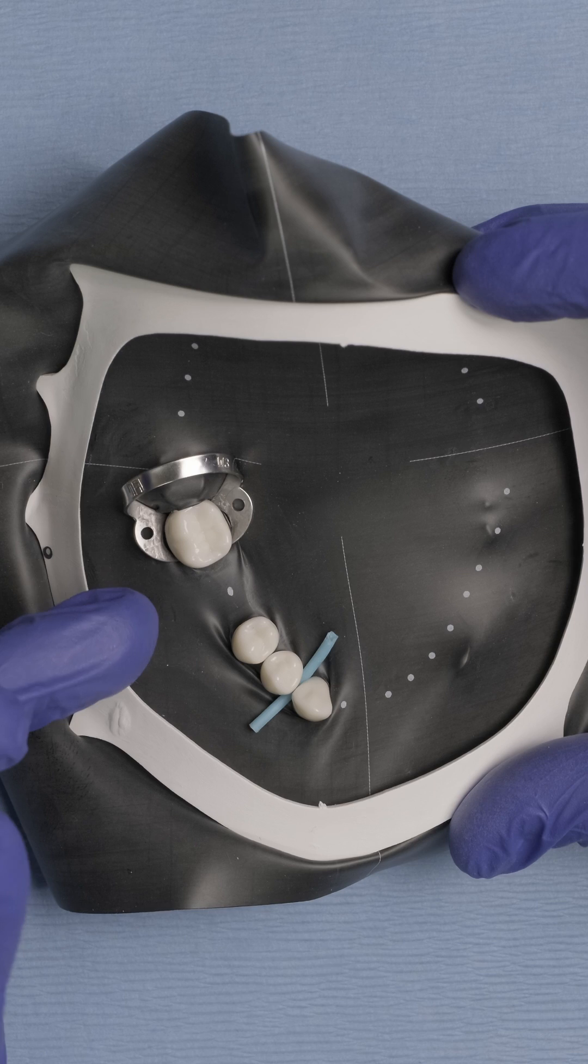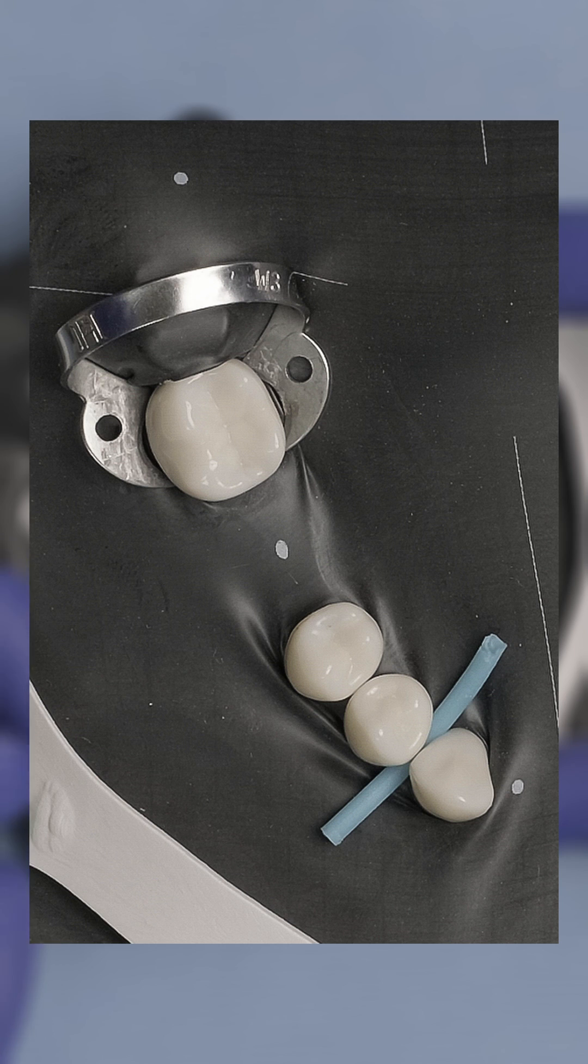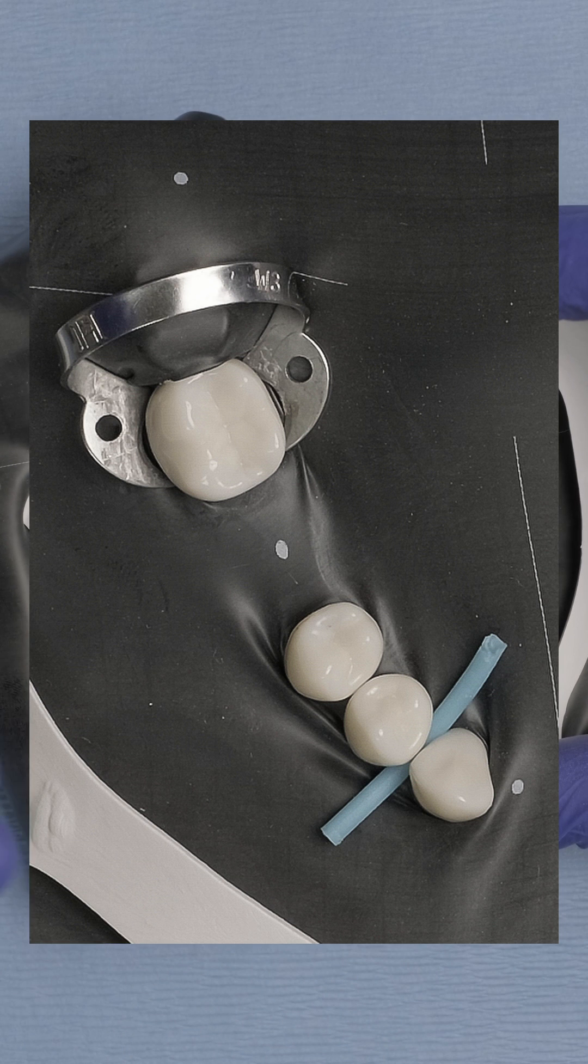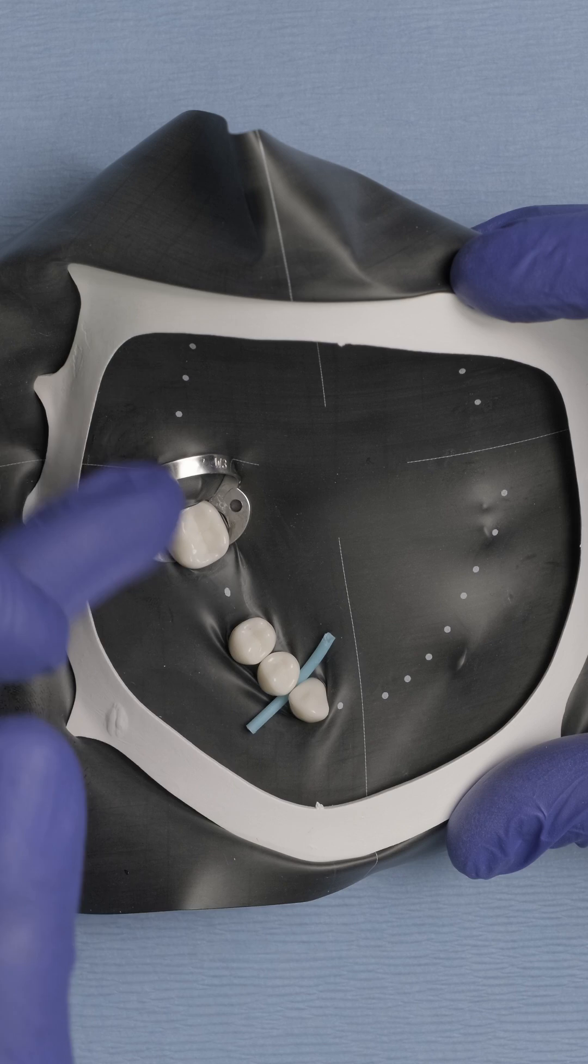See, we have completed our isolation in a really good way, meaning there is no tissue exposed. We don't see any pink tissue through our rubber dam, which also means no saliva contamination, no saliva coming underneath the rubber dam, no blood coming underneath the rubber dam. So no contamination of our operative field.